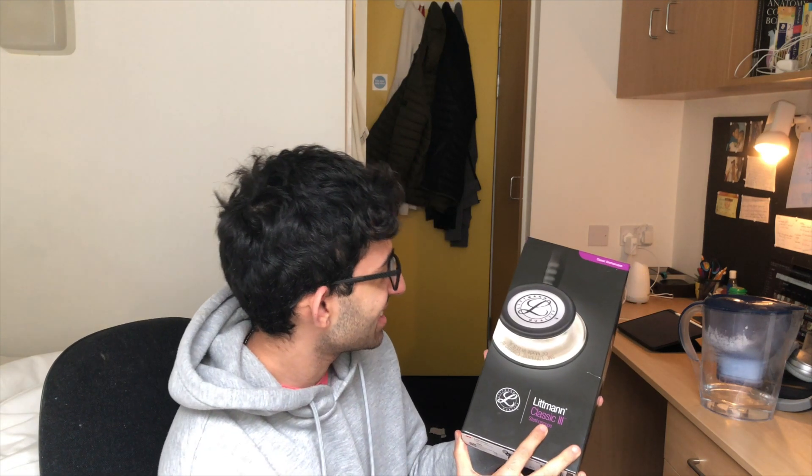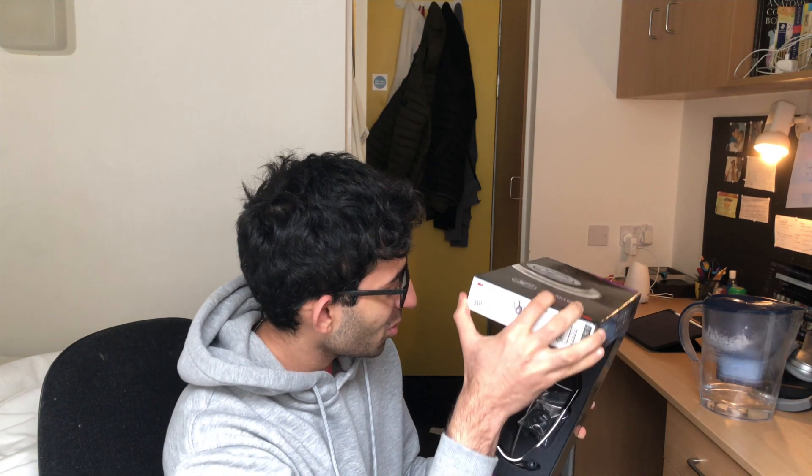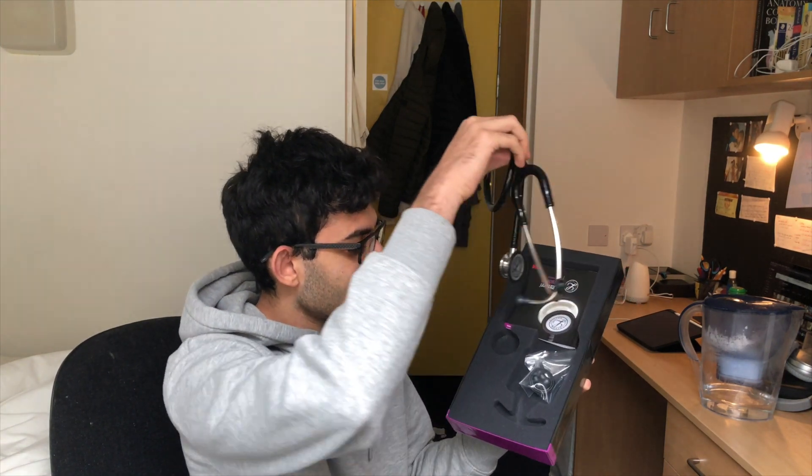Okay, let's go, let's open it. Whoa, so cool! I got the black stethoscope — the black Littmann stethoscope. Yeah, let's take it over and have a look at it.